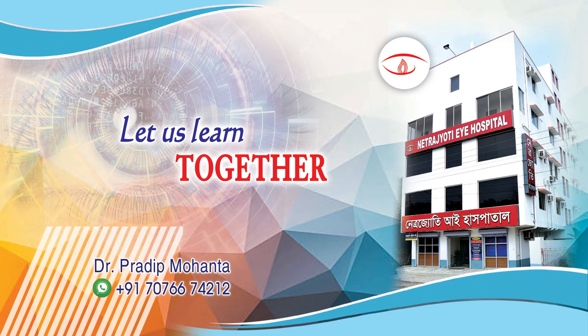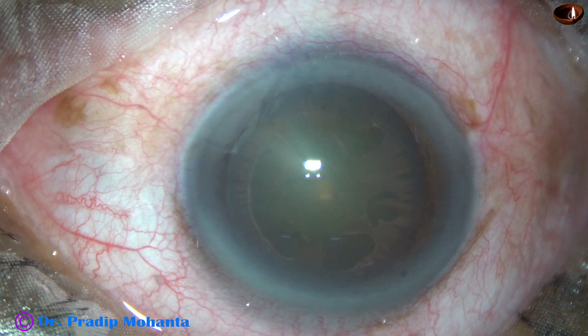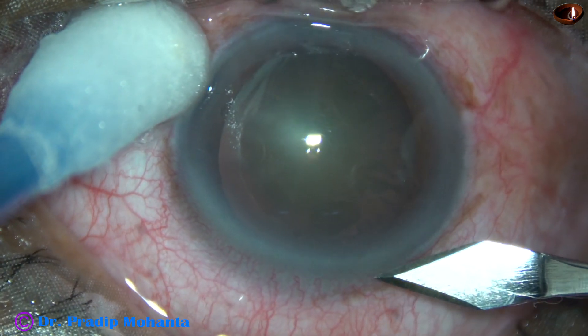Friends, welcome to my workplace at Ranaghat, West Bengal, India. This is a cataract with pseudo-exfoliation material over the anterior capsule of the lens. Let us observe this surgery.